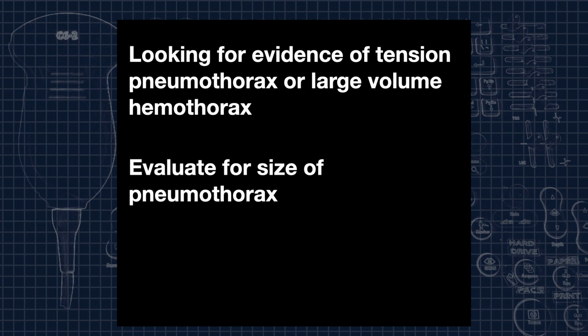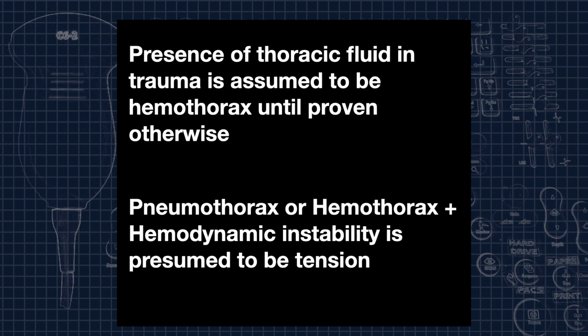And so finding it is one thing, right? But in our evaluation we also have to evaluate for the size of these things. So is this pneumo clinically significant? That's somewhat of a clinical determination. That's somewhat of a sonographic determination. We'll look a little bit at that as we move forward in this, right?